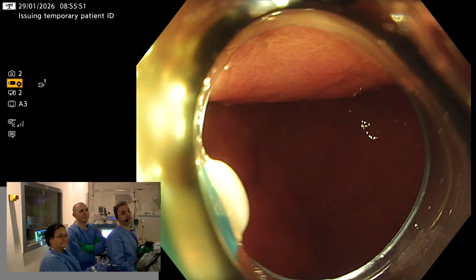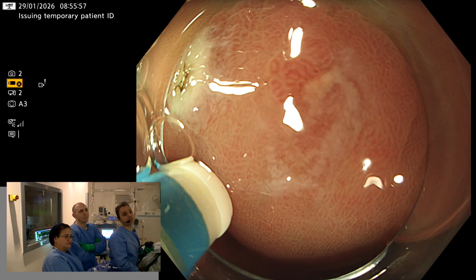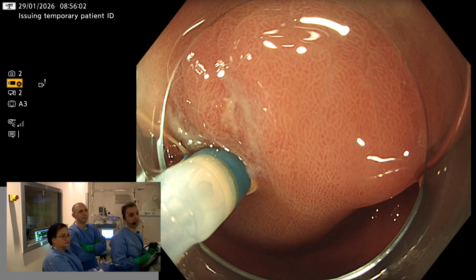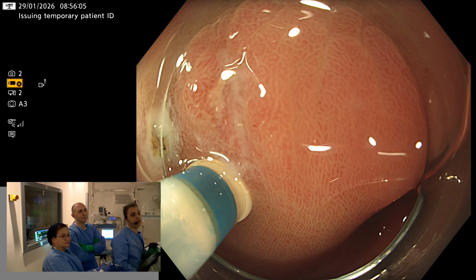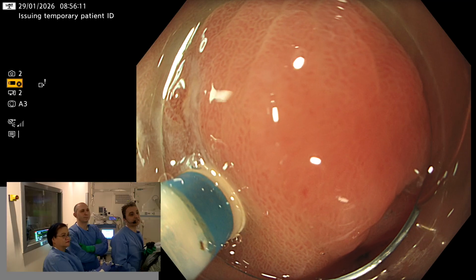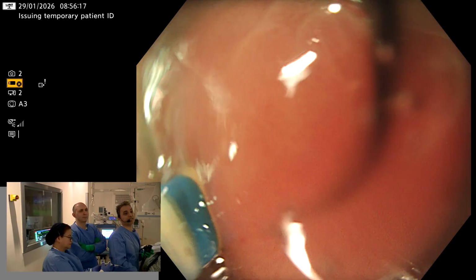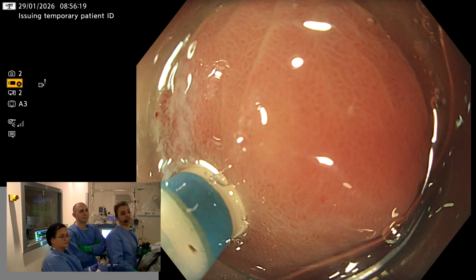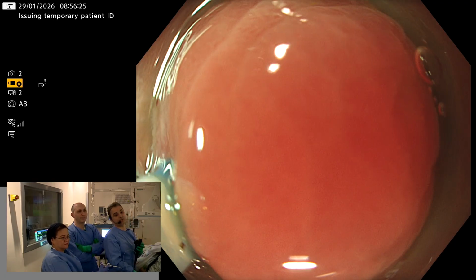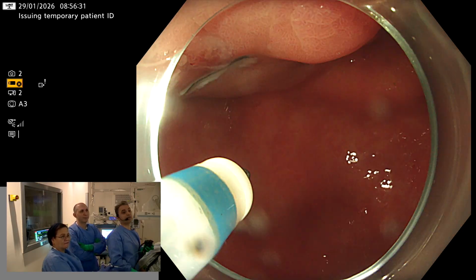So I will start by seeing the marking area. So this is the marking. Needle out, please. So needle out, and I do one sharp cut, and I am sure that the needle is inside the mucosa. So I press with the white ceramic tip, and then I go steady, hooking and cutting. Well-controlled procedure, hook, cut. And sometimes if I face difficulty, I ask my assistant to do some injection during the procedure. But today we don't have any resistance, so I go on and stay on this because I don't want to lose my view.